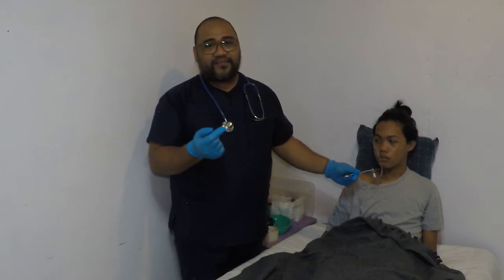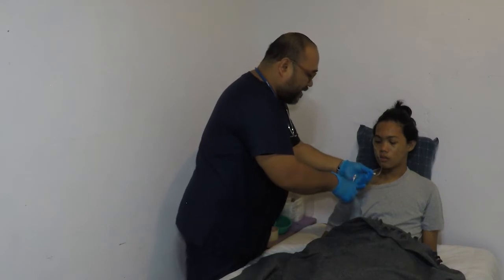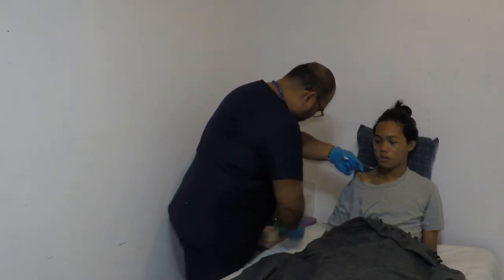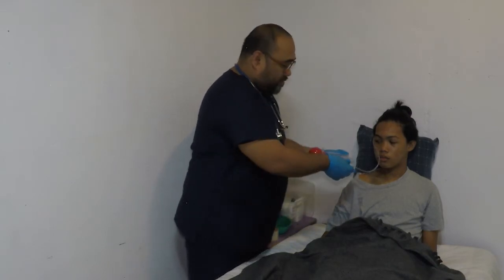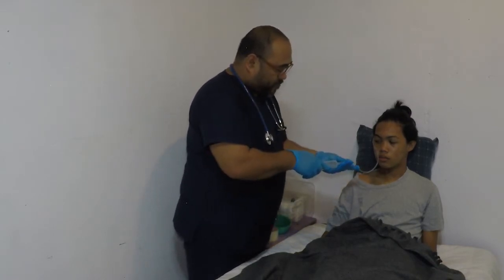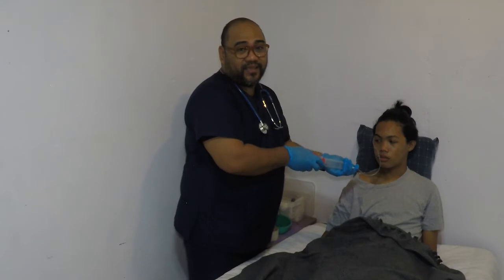Then add 30 to 60 milliliters of water to the feeding bag as the feeding is completed. Then clamp the tube. Like this one, we'll remove the clamp, and then we will put the feeding formula and squeeze slowly.